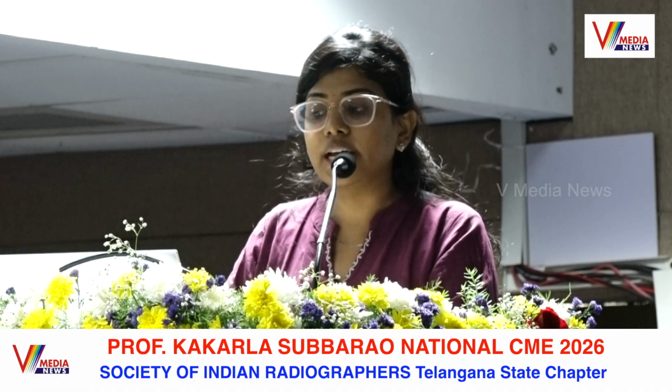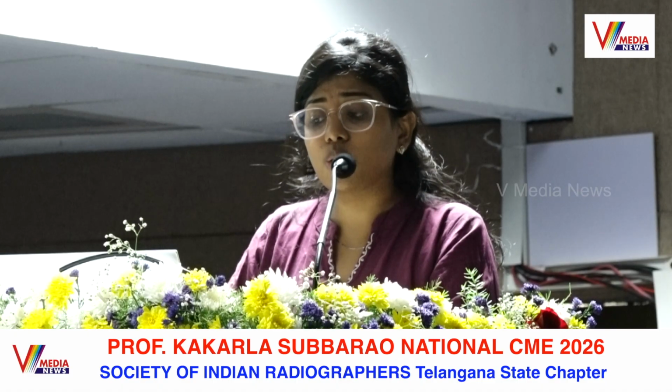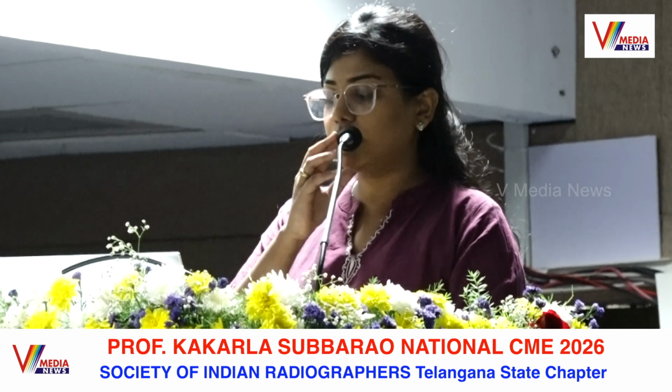The basic contraindications are divided into absolute and relative. Coming to the absolute contraindications: acute STEMI, severe allergy to iodinated contrast, and pregnancy. The relative contraindications are inability to hold breath, irregular heart rhythm, low systolic blood pressure, moderate to severe aortic stenosis, renal failure, and very high coronary calcium score, when it is greater than 1500, because of severe blooming artifacts.